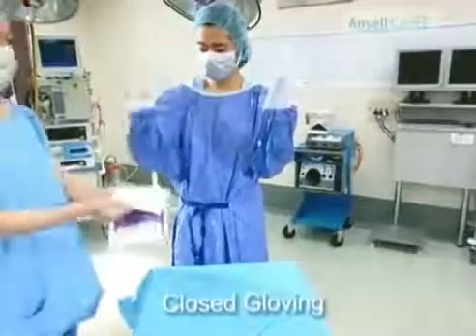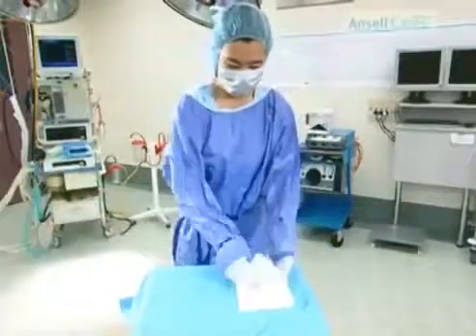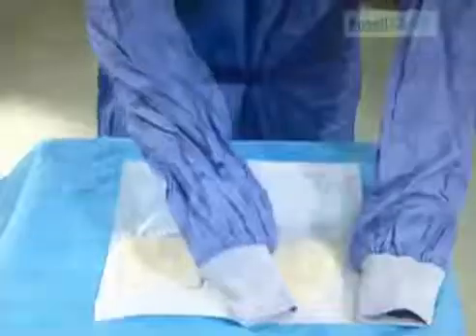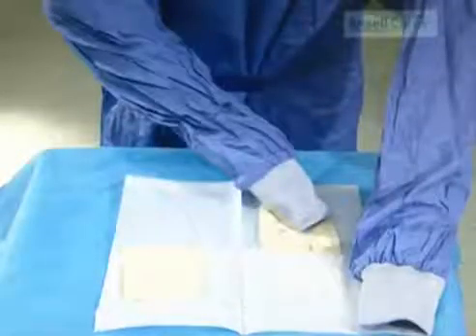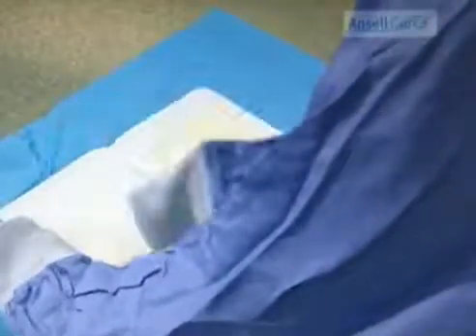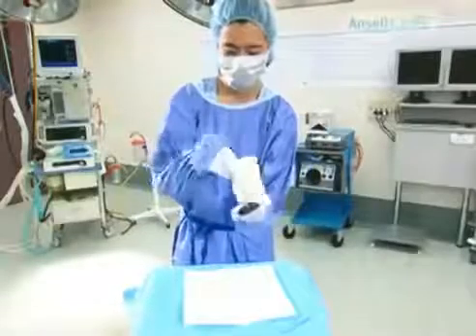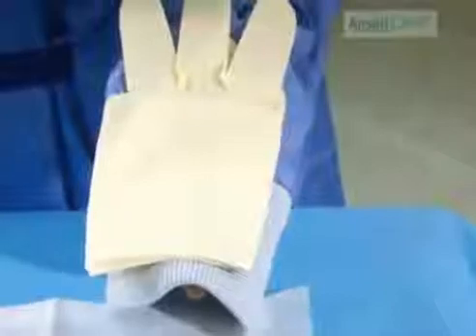Using cuffed hands, open the glove packet and position the gloves so that the cuffs are nearest to you and the fingers are pointing away. Using your right hand, pull the left glove cuff down from the package by the fold of the cuff. Press down on the edge of the packaging to ensure there is no movement of the other glove. With your right hand still inside the gown, pick up the left glove and place it thumb to thumb, cuff to cuff. The glove fingers should be pointing towards your elbow.